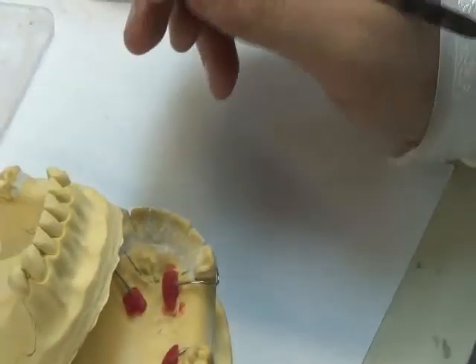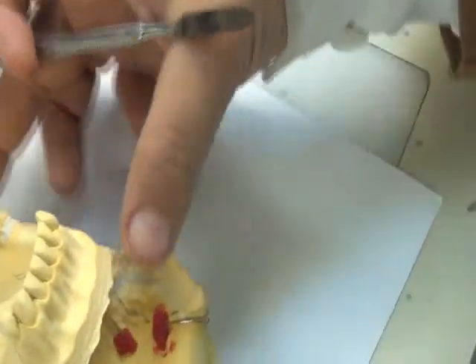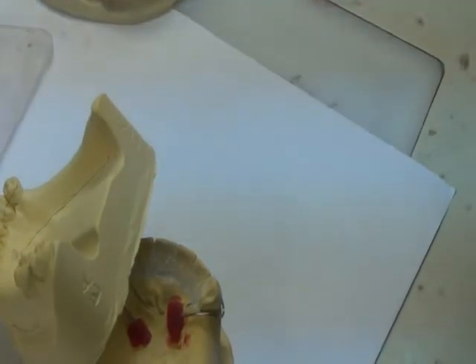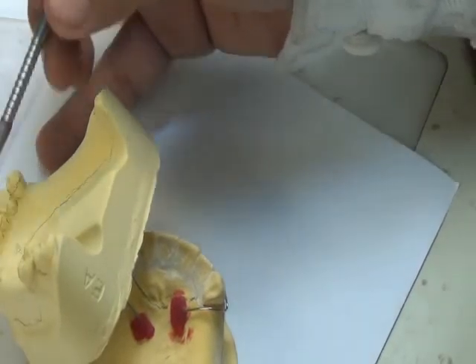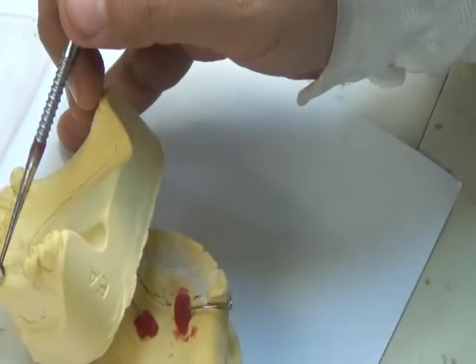This type of blockout, parallel to the path of insertion and removal, we make in many places that come in contact with the hard denture material. So we also do it on the other abutment. We repeat it on the second abutment.